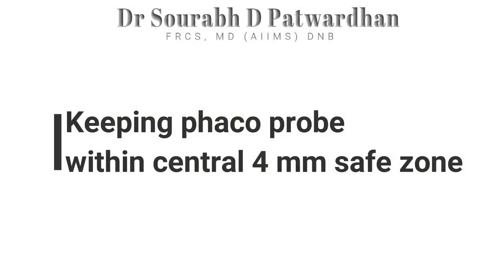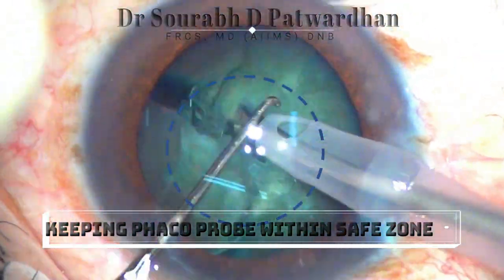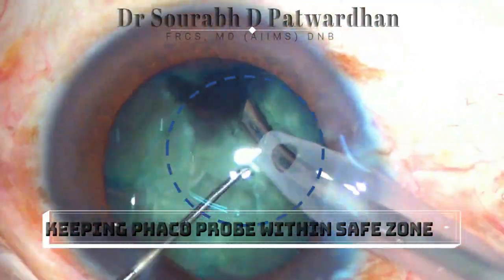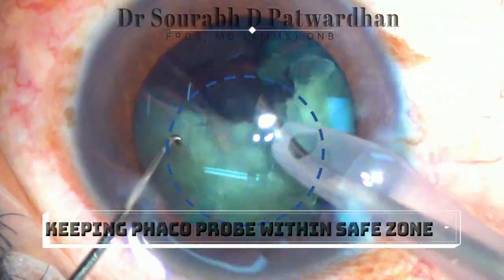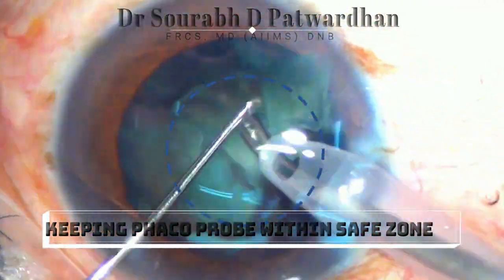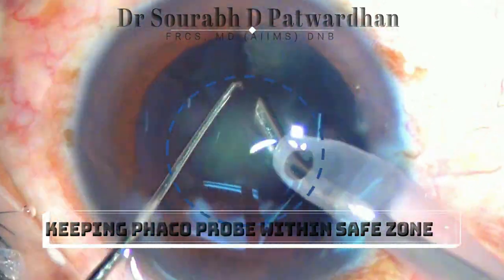Keeping the FACO probe in the central 4mm safe zone is of utmost importance, and you can review your videos again and again to check whether you are following that rule. Because if you are going away from this safe zone while doing FACO emulsification, you will find that your complication rates will increase.